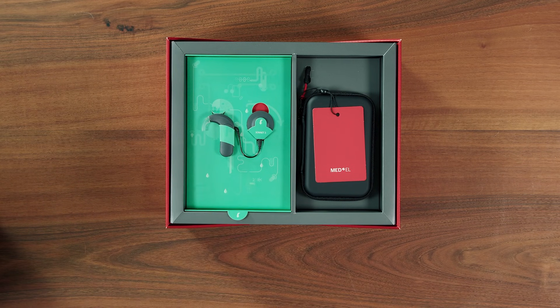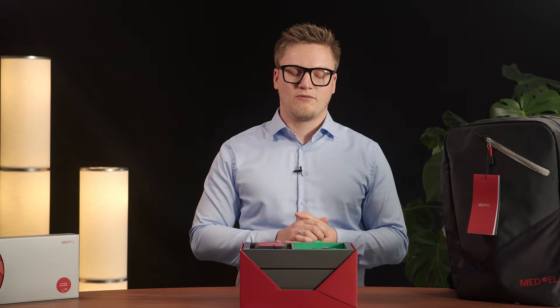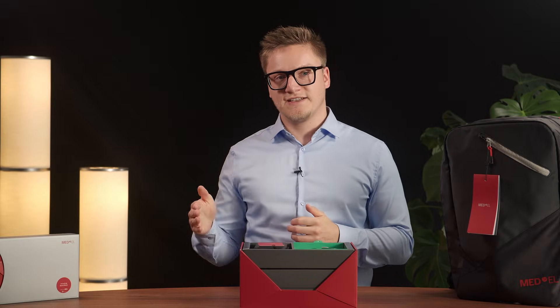Sonnet 3 is our latest behind-the-ear audio processor for Medel cochlear implants. It is our smallest and lightest Sonnet ever. It comes with disposable and rechargeable batteries. Sonnet 3 works with all our cochlear implants dating back to 1994.